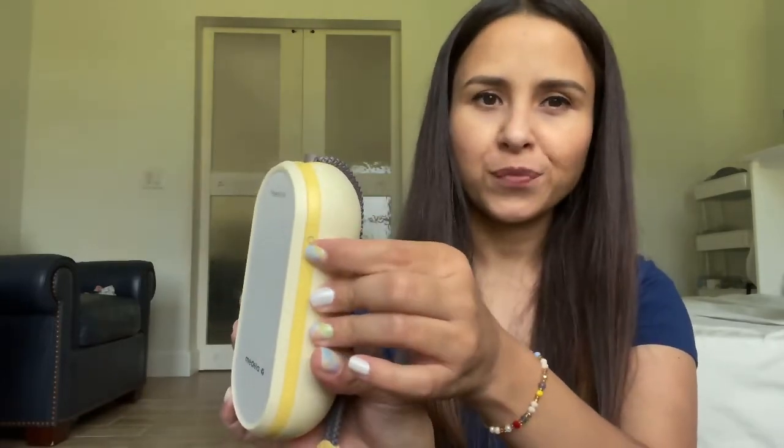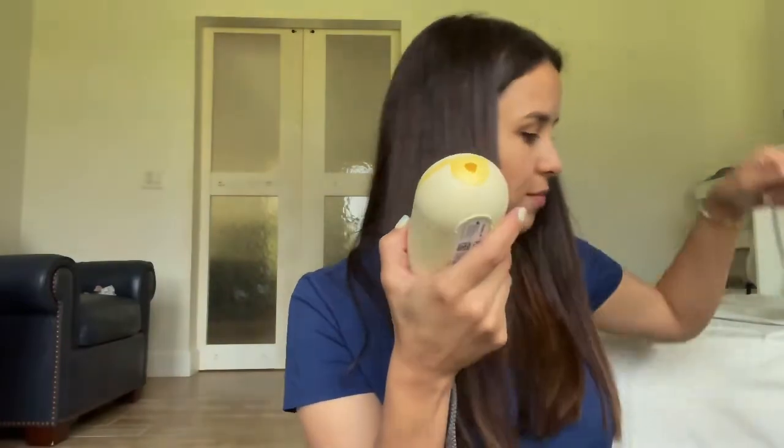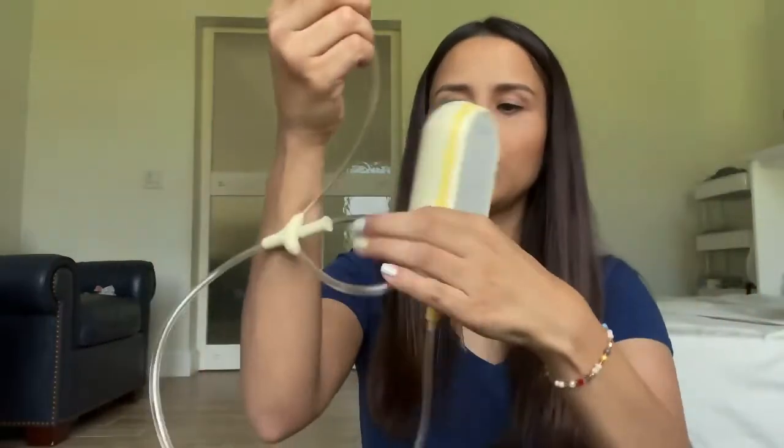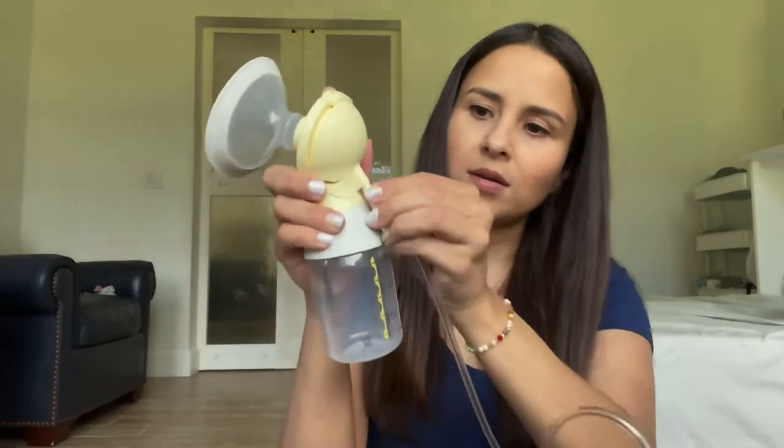I pump once a day and this thing lasts forever, so it's pretty easy to use. You have your button here to turn it on, you have the charger here, and this part is for the cables you're going to need. The cable wraps here and then you have the option to do one or both sides. In my case I only do one, because usually I just breastfeed one side and pump the other side. If you're only doing one side, you just put it here in the center, connect these right here and you're good to go. Then you wear your top and you're free.